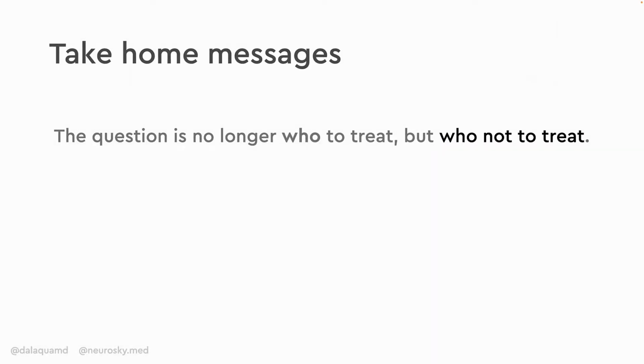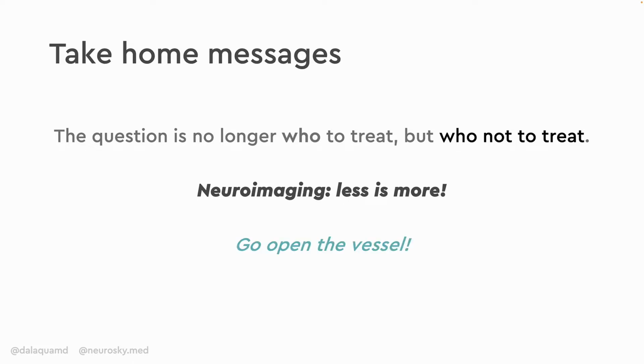So as take-home messages, the question is no longer who to treat, but in fact who not to treat. Neuroimaging, think about it, less is more for stroke and even in the late window. So go open the vessel and leave no LVO left behind.